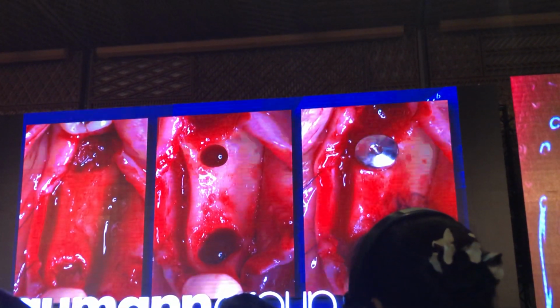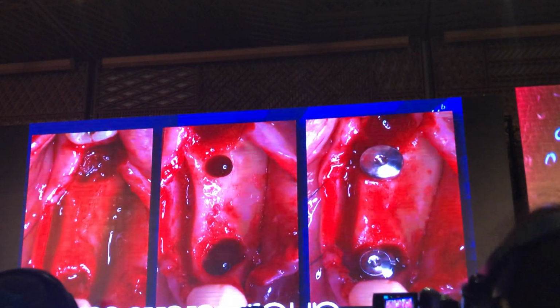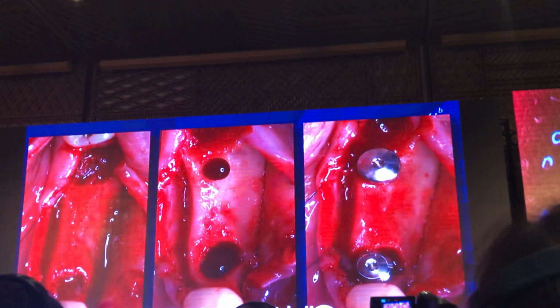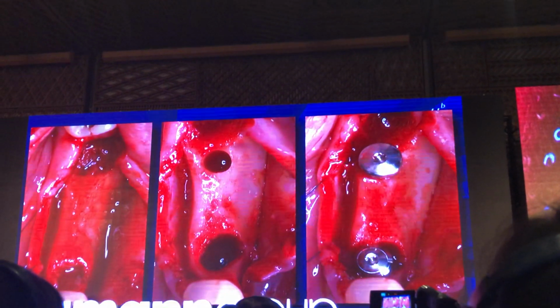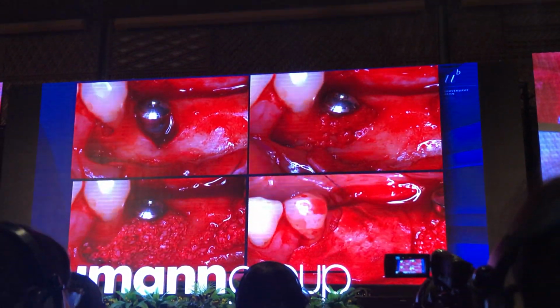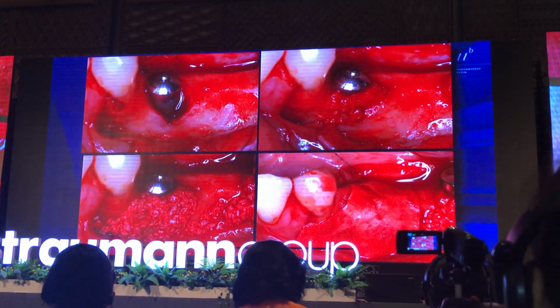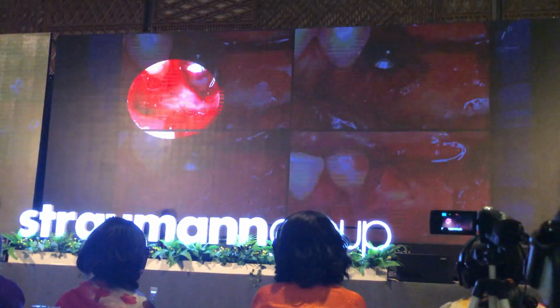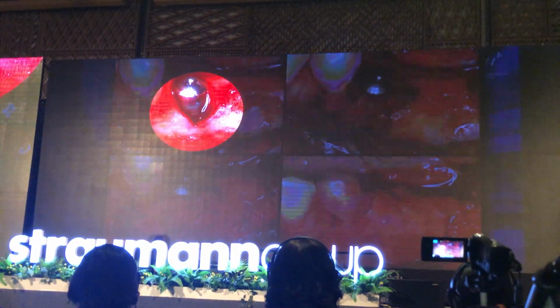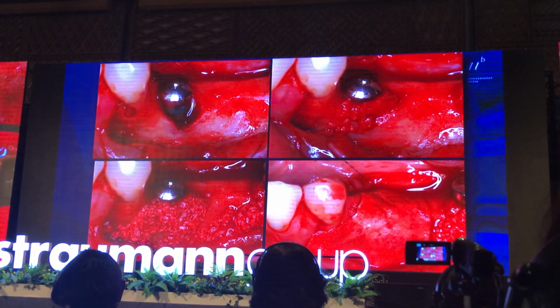You just put it slightly deeper, because as you see at the top, the bone is rather thin, but it's getting wide very quickly. Today I might even take that off, but that surgery was done 14 years ago, 2004, if I recall correctly. So the implants were placed. You see then the first implant. The premolar implant was augmented the same way. Very important now, you see, very important, that this is a two-wall defect, and as you can see here, the defect has a horizontal component.